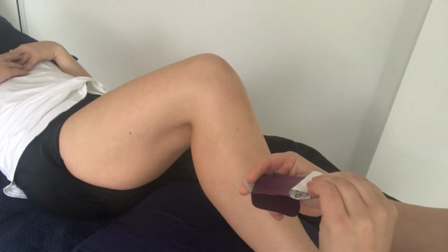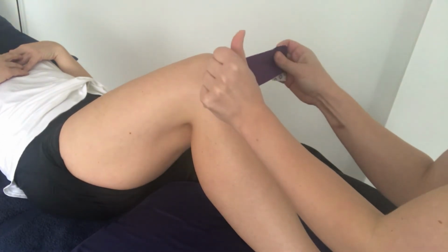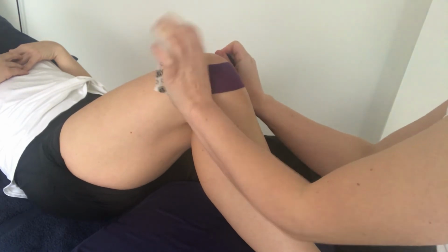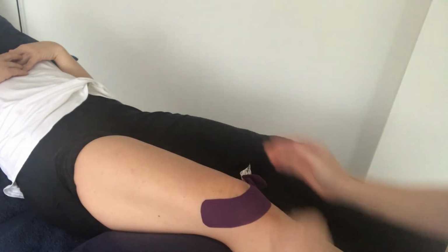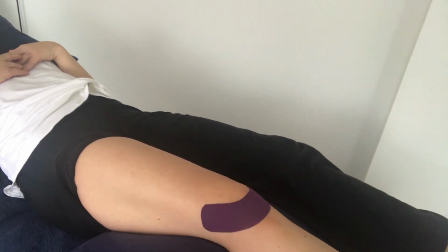And once you have finished the quadriceps inhibition, we can start offloading the tendon at the patella, and you can do this on its own also. So you break off the paper at the centre of the tape, and then you want a heavy resistance, a heavy tension on the tape. And you want your anchor to go in and upwards towards the patella. Stick the section down in the centre and then relax the knee to apply the anchors on both sides and then rub to stick the tape.